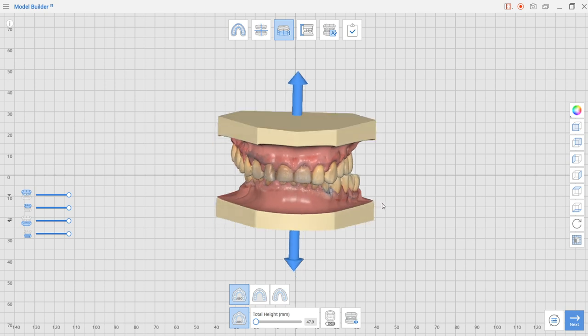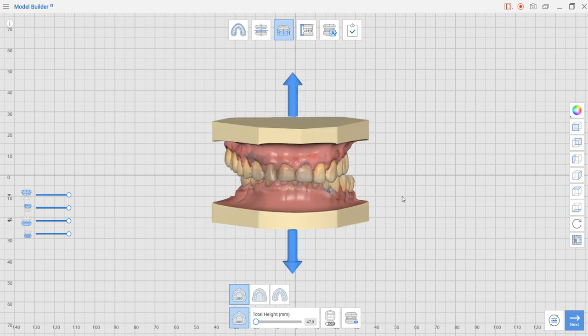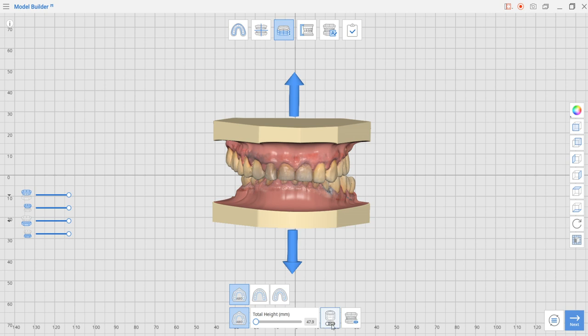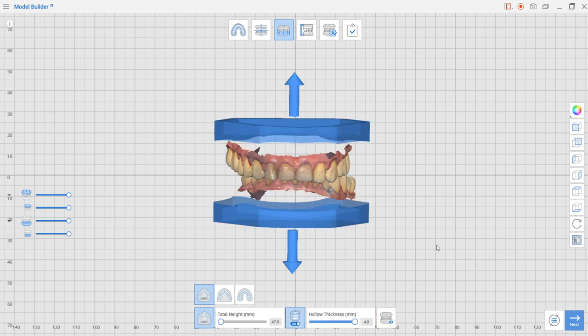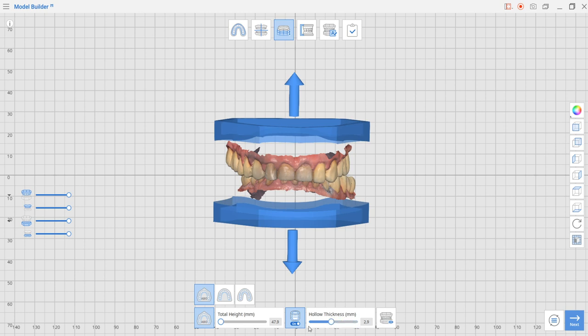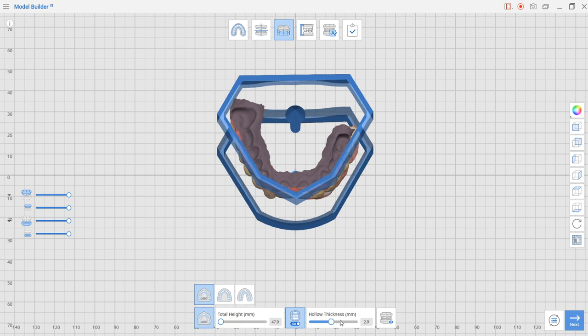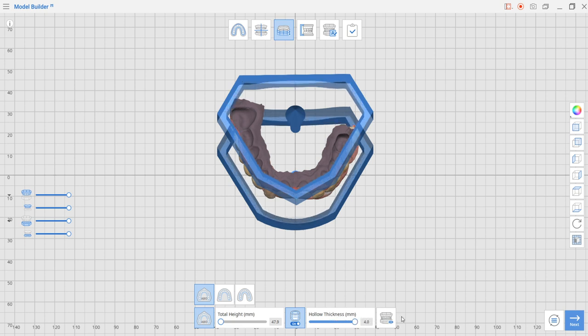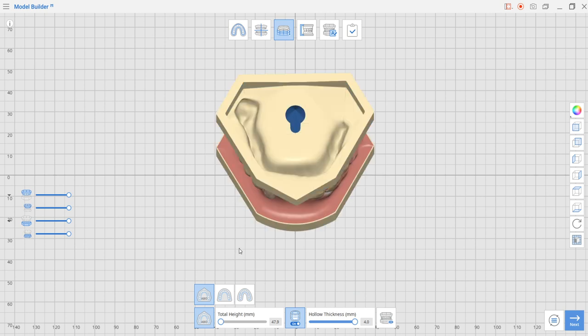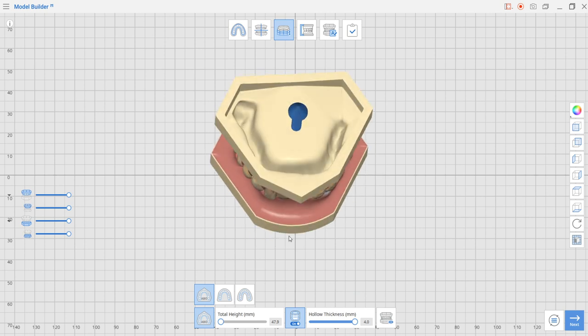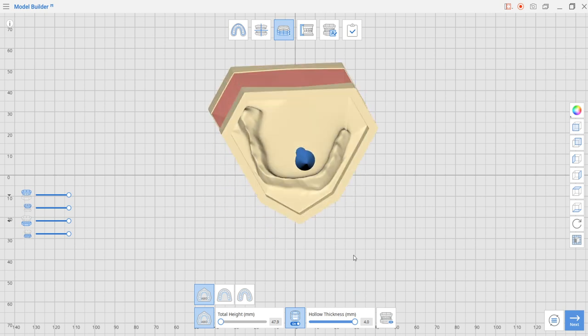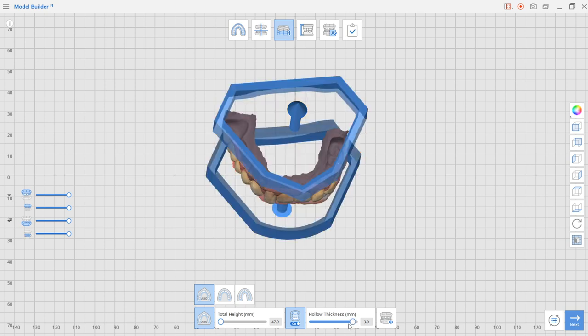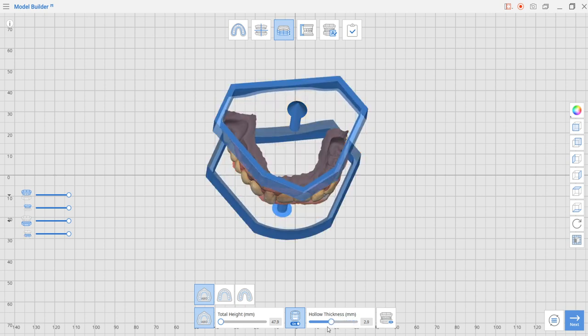Because it's going to print a lot of material if you leave this selection like this, Medit also added hollow models and they can be selected from down here by pressing the button. Hollow models come with walls and you can select the thickness of the wall from two to four millimeters. You're going to see the thickness of the wall being modified in real time.